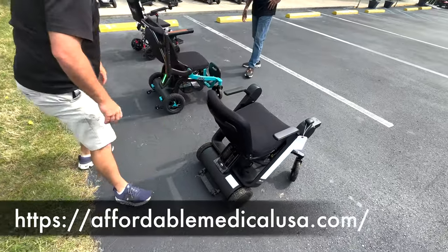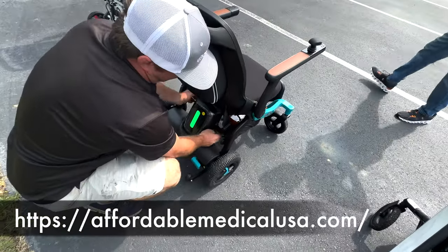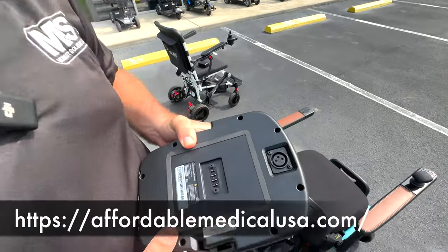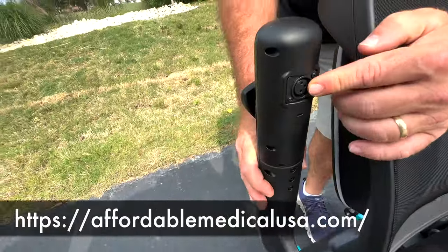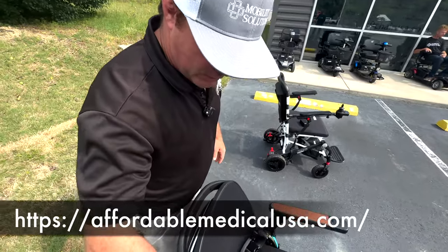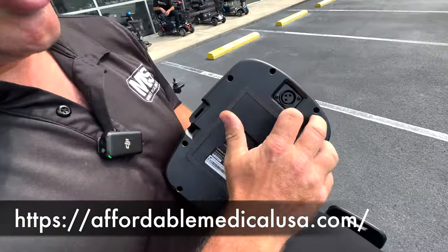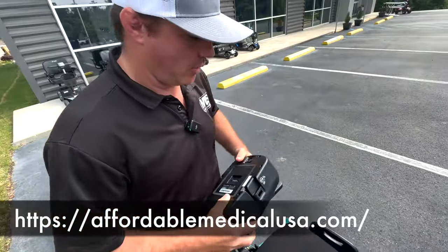The battery over here on the other one is about the same. I like the handle on that. You can charge it through here, but the benefit is you can also charge it directly through the joystick. So if you're using this inside your house, if you live in independent living and you need to charge it, it's easily charged through here. Or if you're traveling a lot and you don't want to take the chair inside, you could take just this battery pack inside and charge it through here. This is a 20 amp hour battery. This is the long range battery they have at the moment.